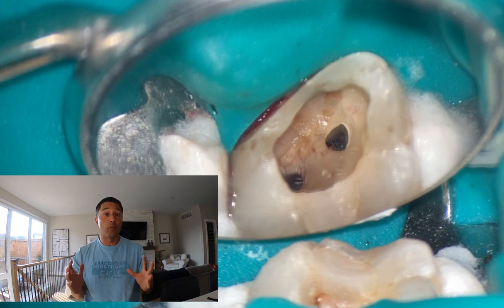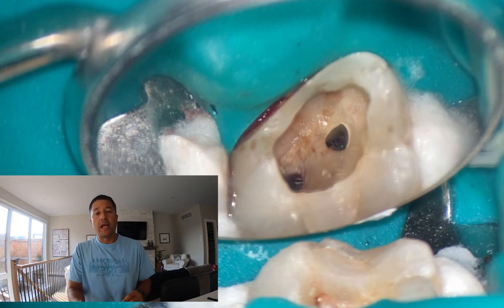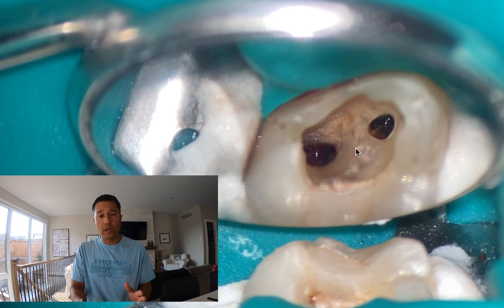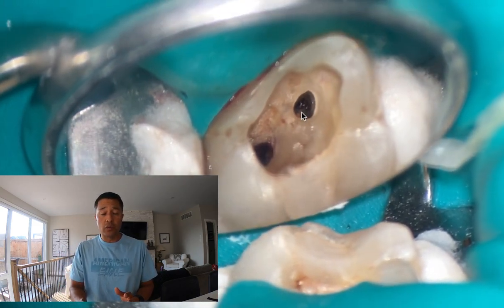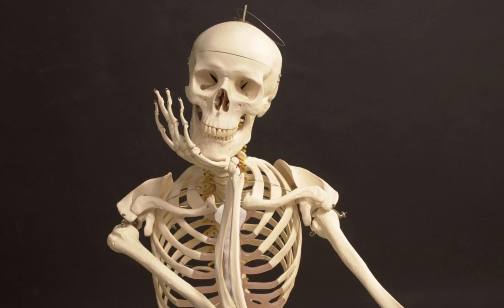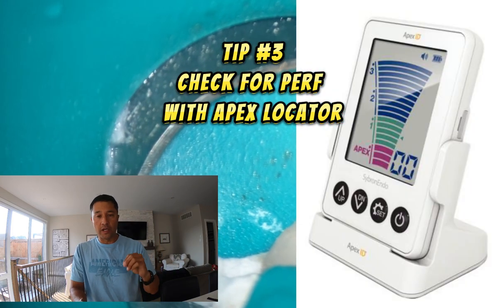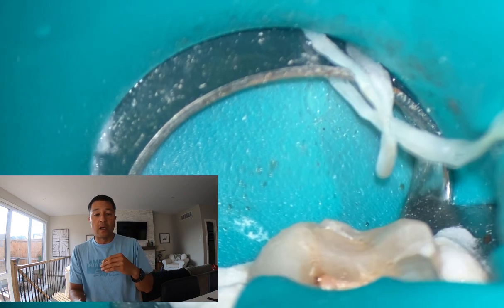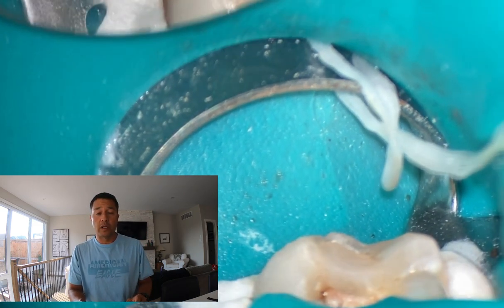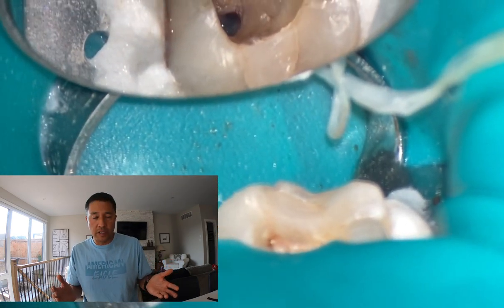This is a great case because it's a wide open pulp chamber, and that's why the student actually tackled it. What I'm thinking is: it was an open pulp chamber, this looks like pulp tissue, not bone — I've been down that road a few times in my career. Bone does not look like that. You could also take an apex locator, take a file, and put it in there. She had done that and got working length on the mesial buccal canal and the palatal canal. So what I'm thinking is that the roof is just not unroofed — it's still there.